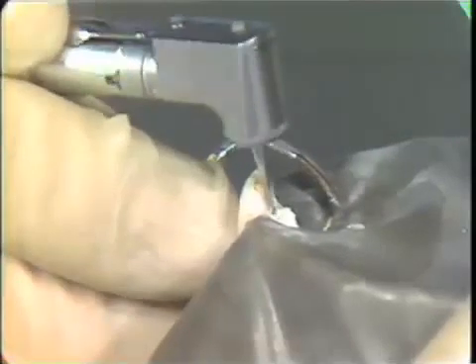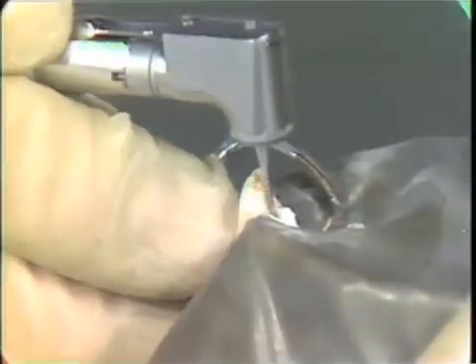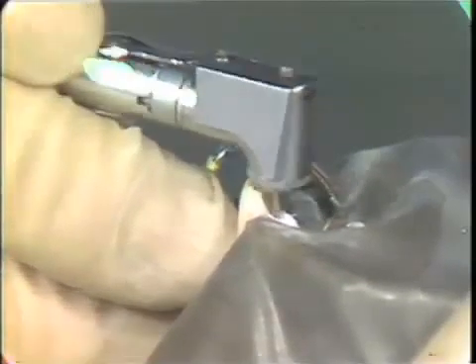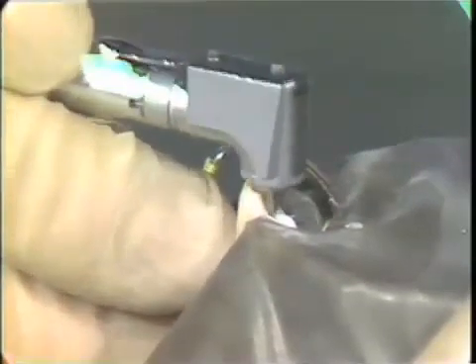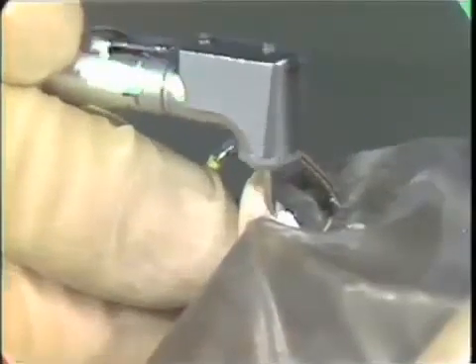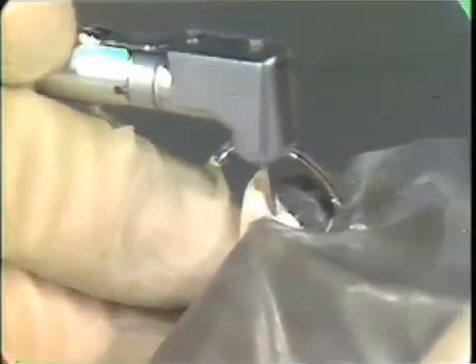I feel a little bit on the lingual, so I go back and unroof. Making sure to keep away from the walls and run the burr only against the roof. I check again. It feels fairly good to me, so I put my slow-speed handpiece aside.